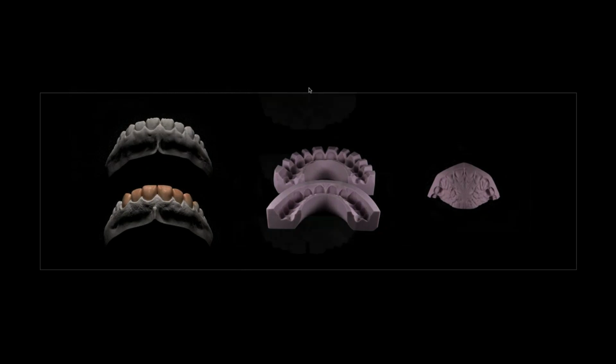Why diagnostic wax-up? It's very important for us. It's not only important for me as a dental technician to see the function and to see the prototype, how it can look in the mouth. It's also very important for the patient that he can see the final result in their mouth. So it's easier to present the patient the final work if he can see that in the mouth.